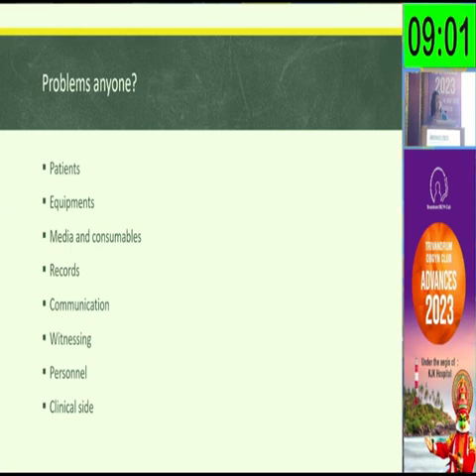What was the culture media that was used? What was the batch of the culture media? The oil, the consumables, the processes, the CO2, the triple gas, the water that I used, everything needs to be analyzed until the last stage.